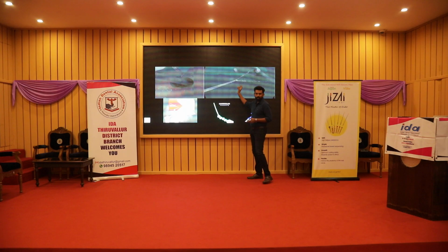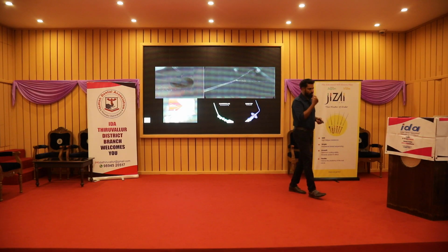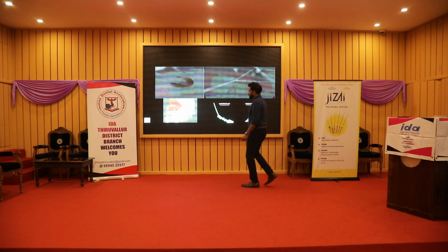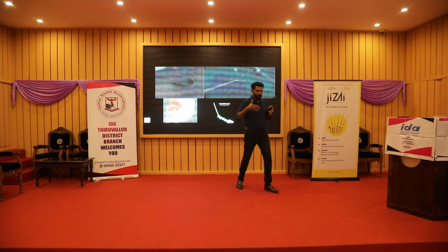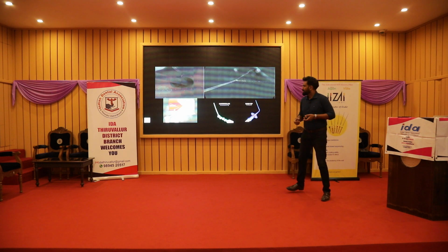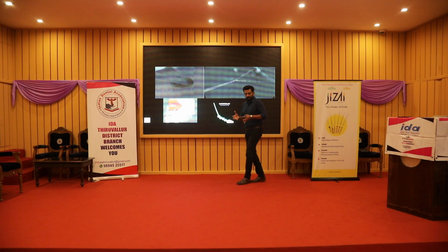Irriflex. This is a side vented needle, available from PD. This is an excellent irrigating device. It has a tip diameter of 0.30 and a taper of 3%. So when you enlarge the canal to size 30, this irrigating device can easily travel inside the canal and irrigate the canal completely.